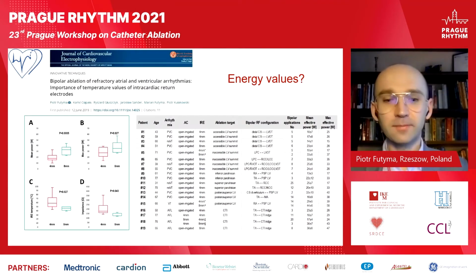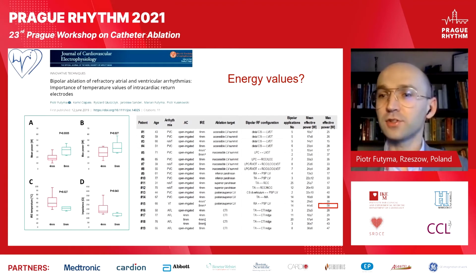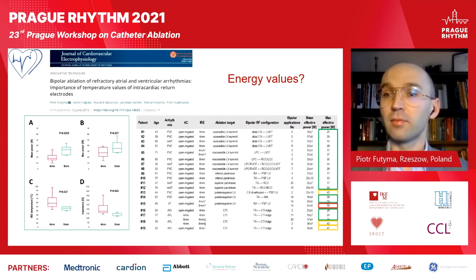And actually, in our experience, a minority of patients required high power ablation. Here is one patient from our study. Some patients required energies between 40 and 47 watts, and the vast majority of patients actually underwent ablation at the level between 20 and 40 watts.